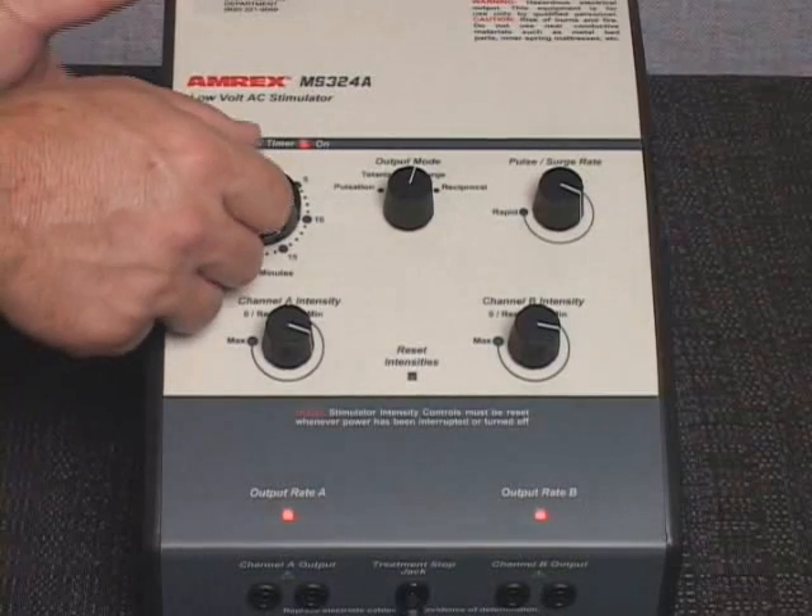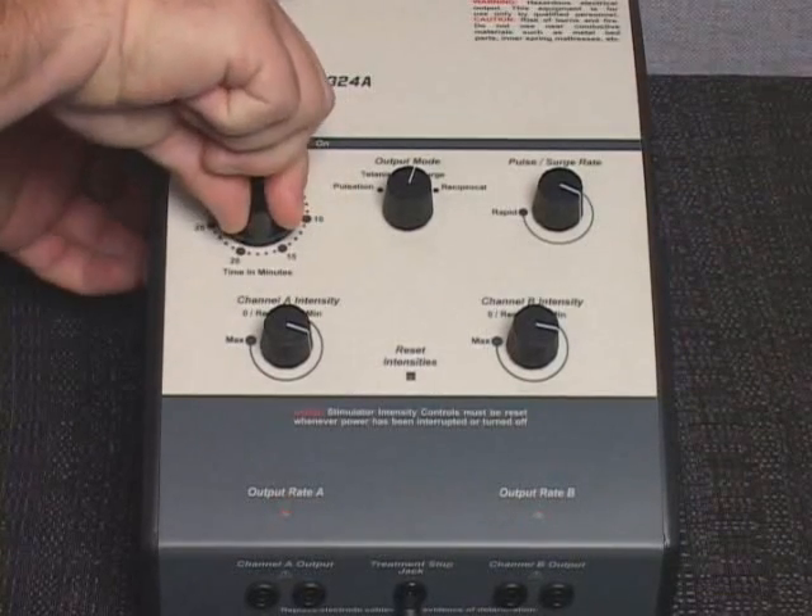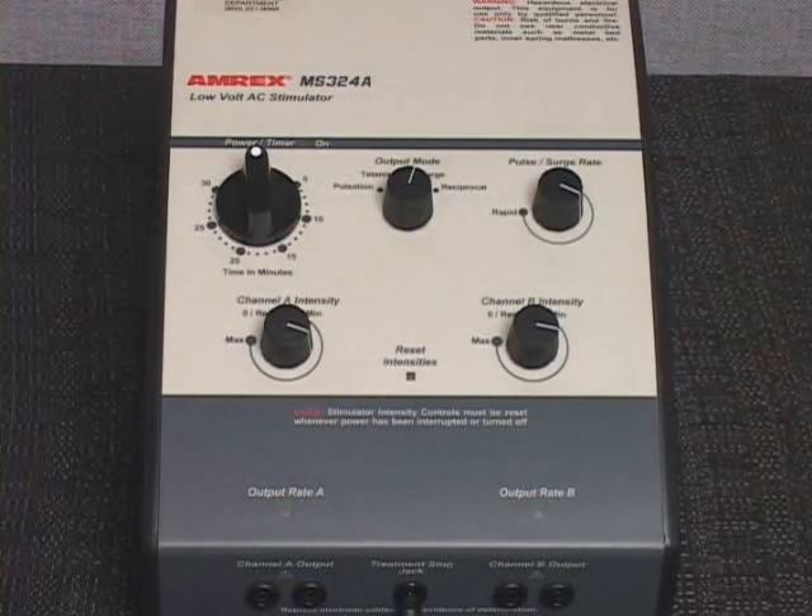To prematurely end the treatment, rotate the power timer knob counterclockwise to the off position. The AC power will shut off and a bell will sound.